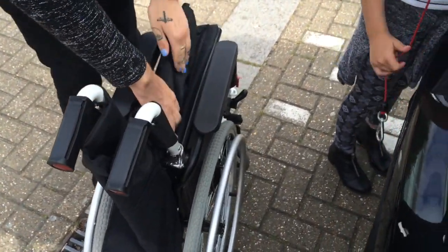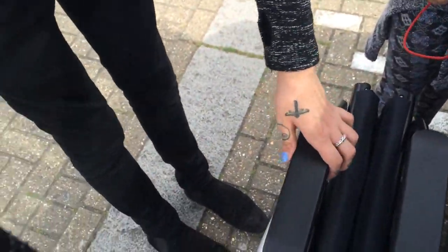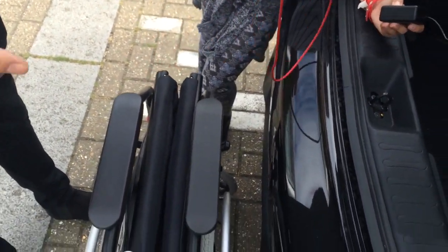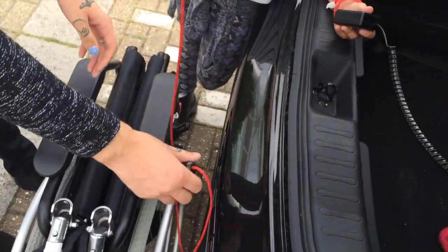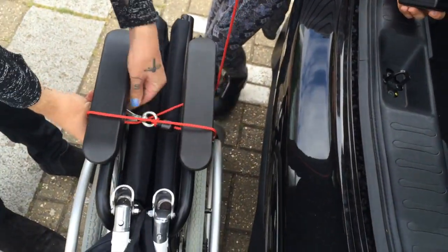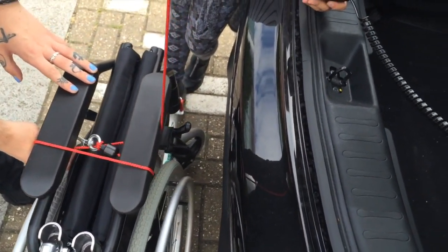Then what you have to do is obviously fold the wheelchair up. The red cord has a little remote control saying up and down, and you have to press down to get more of the cord, and you keep going until you've got enough to loop it through the arms to secure it. You can either do it once or twice — Sam tends to do it twice but I just do it once. Then you press the up button and it lifts the wheelchair.